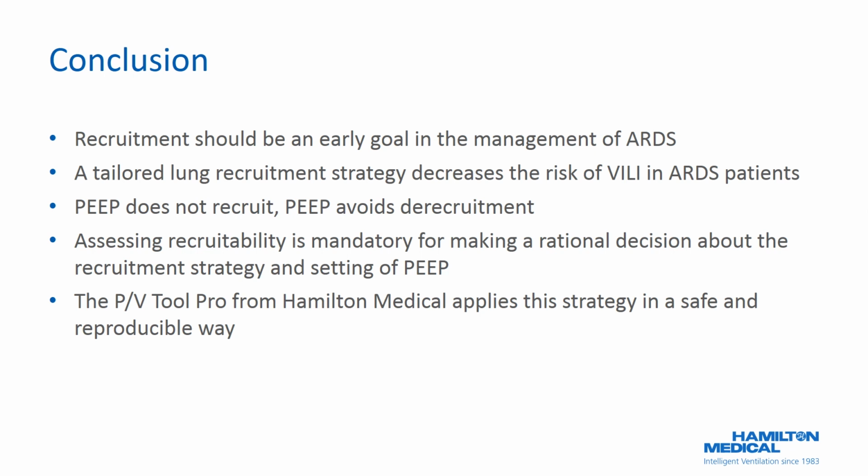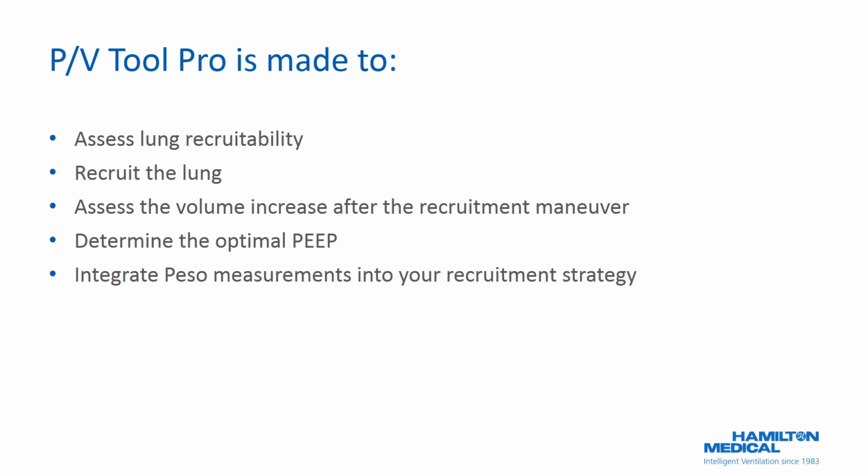The PV Tool Pro from Hamilton Medical applies the strategy in a safe and reproducible way. The PV Tool Pro is made to assess lung recruitability, recruit the lung, assess the volume increase after the recruitment maneuver, determine the optimal PEEP, and integrate esophageal manometry into your recruitment strategy.